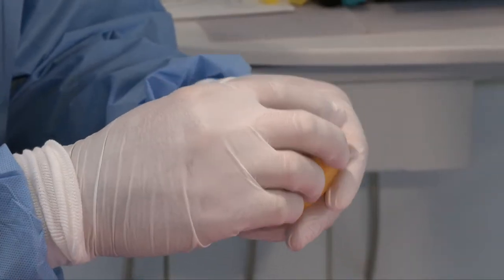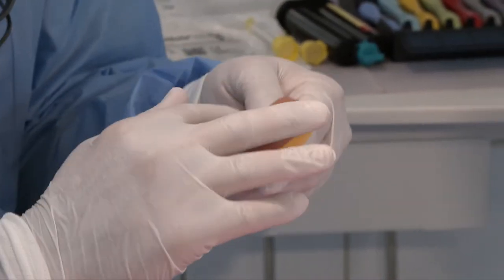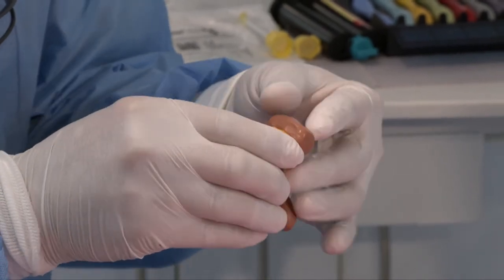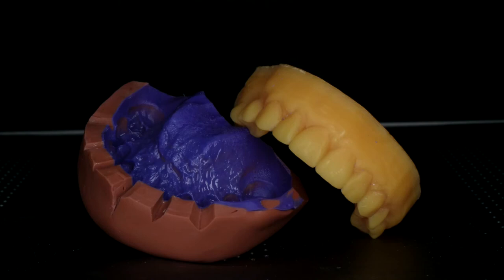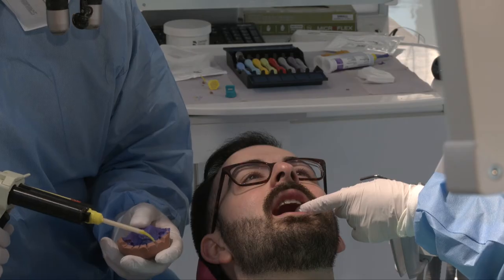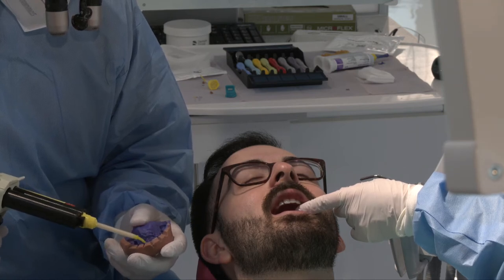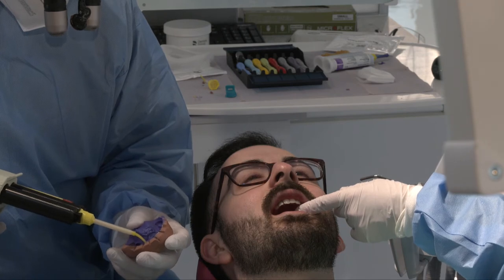So here we're gonna go ahead and, this is some polyvinyl siloxane putty, and we're gonna do an initial adaptation, and then we're gonna let that set up, and then we're gonna do a light body wash with an additional layer of polyvinyl. So here you can see the final product. And what we're going to do now with this product is we're going to essentially transfer this to the patient's mouth, and they're going to be able to try their smile that we designed together live at this appointment, this initial consultation appointment. Like I said, I like to schedule about an hour and a half for everything.